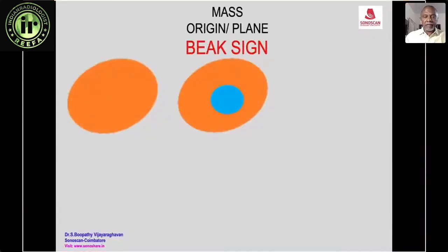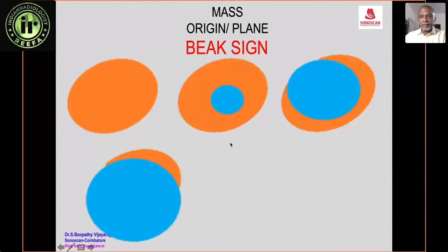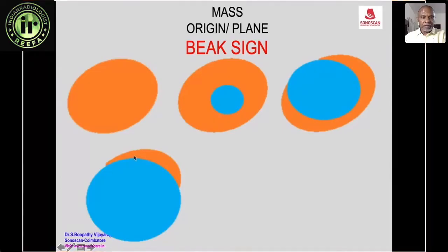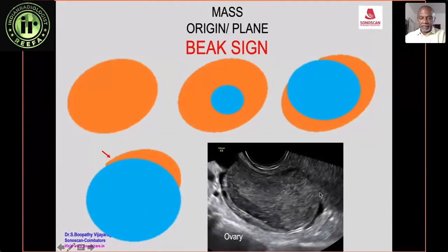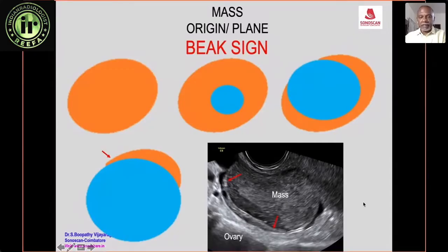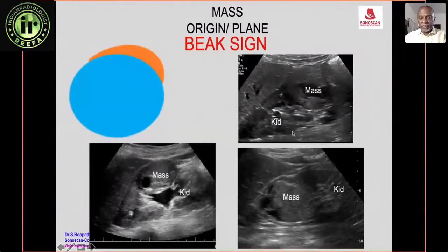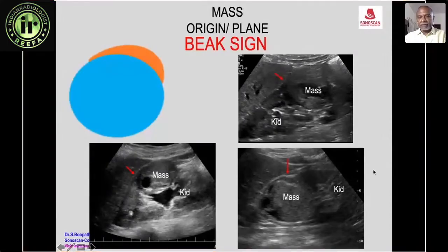The beak sign: when a mass arises from an organ and enlarges significantly, the remaining organ tissue gets compressed and forms a beak over the mass. If the beak sign is present, the mass is confirmed to arise from that organ. An example shows a large echo-poor mass with compressed ovary forming a beak on either side. Multiple renal masses also demonstrate the beak sign, confirming renal origin.